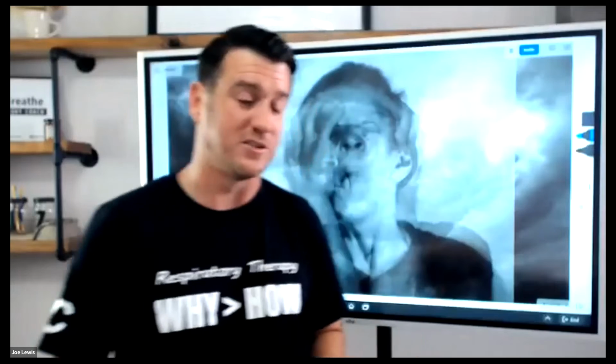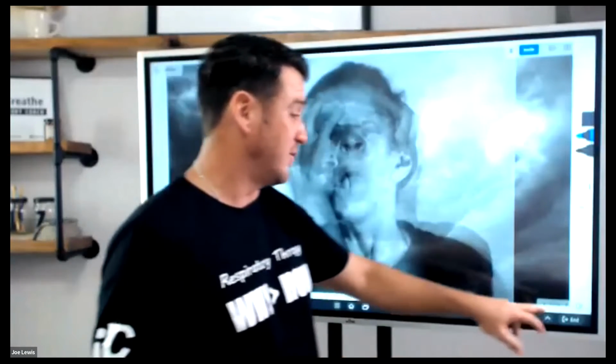They may not have to stay like that. They may not need that extra flow forever, just enough to help them catch their breath, to go, thank you, I was dying over here. Literally, probably what it feels like. So keep that in mind. Are we satisfying our patients' neural drive to breathe? P100 is extremely valuable, along with your waveforms.